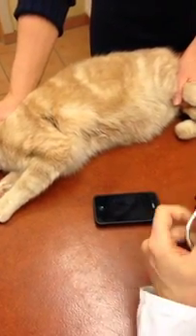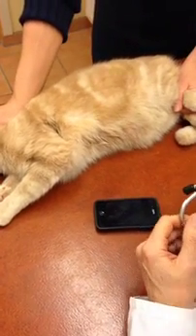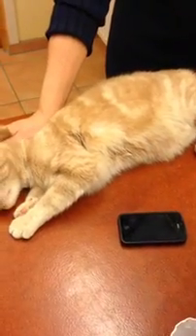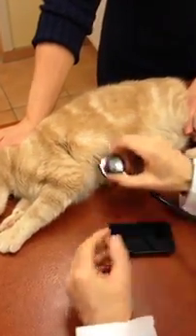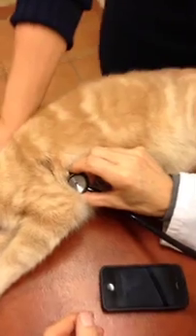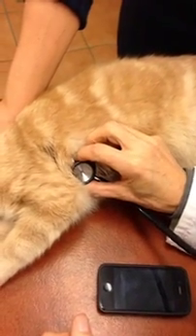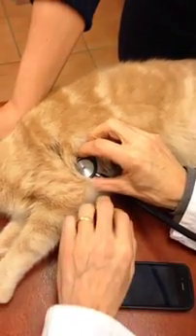We will now start and try and take a live core EKG on this cat Colin. The first thing I do is I try and localize the point of maximum heart sounds with my stethoscope.